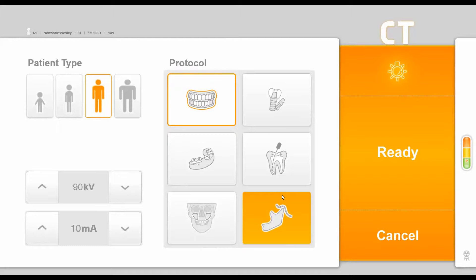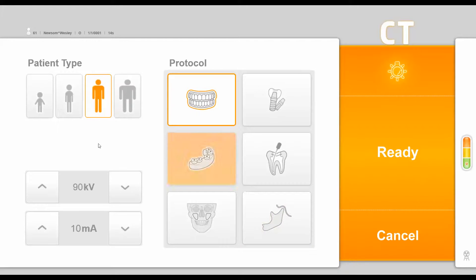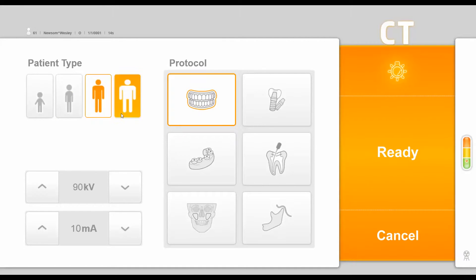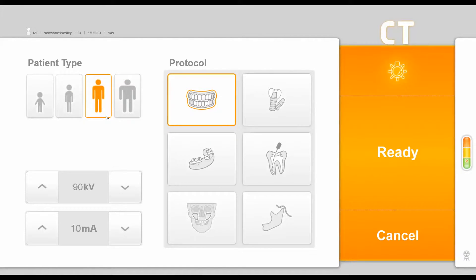In the top left corner, we can choose our patient type from a child to a small, medium, or large adult, and you will notice that it defaulted to the medium adult setting. You also have the option to change the KV and MA settings in the lower left corner if you decide.